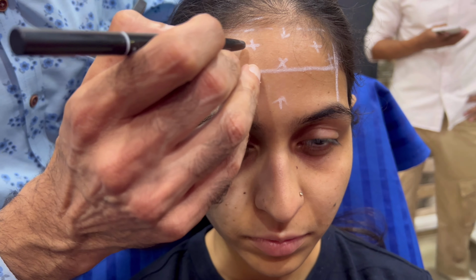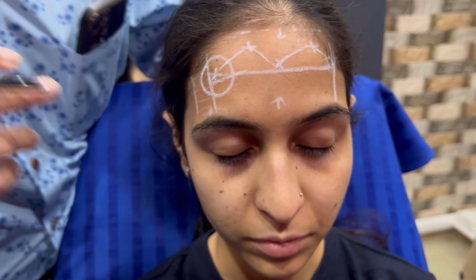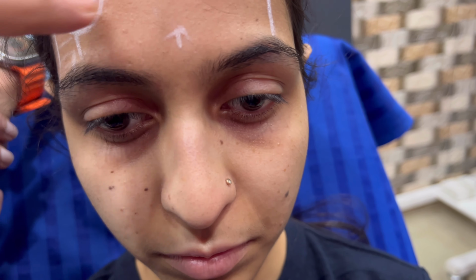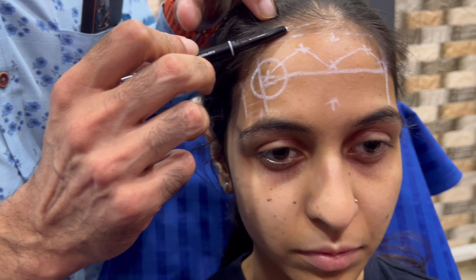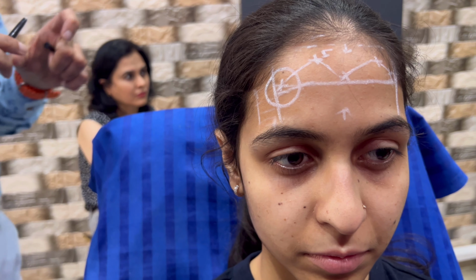So I'm going to do an M pattern of injection, which is the conventional M pattern for my injection of toxin in this area. And this point is the midway between the 2 points. And I don't want to go too high up also because that will be in the hairline, so there is no point, right? So I'm going to put 4 units per point. So this is 4 units per point, and I have done 20 units radius.